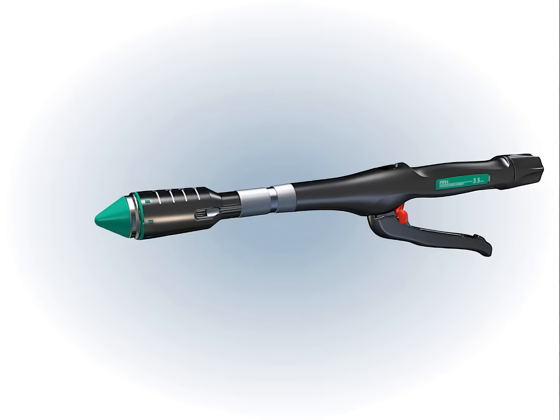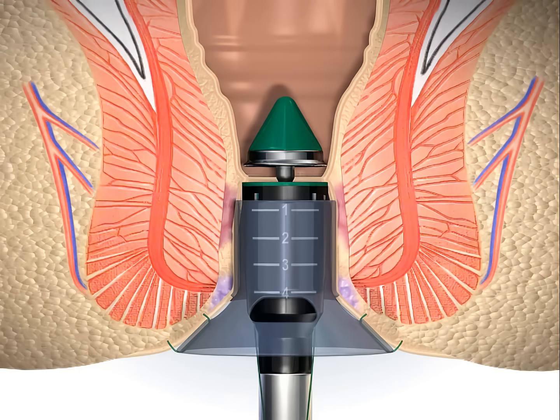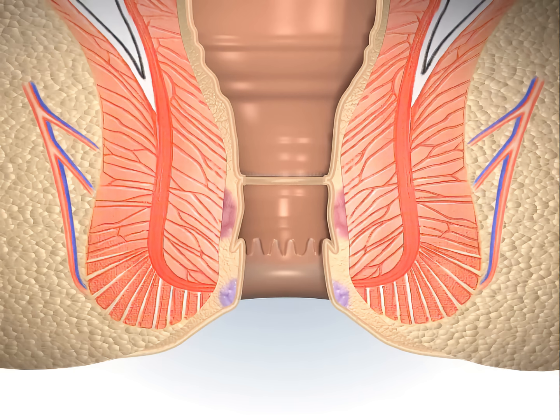A half to three quarters turn of the adjusting knob of the stapler facilitates its extraction. Additional turns can cause interposition of mucosa between the anvil head and the upper edge of the circular anal dilator.